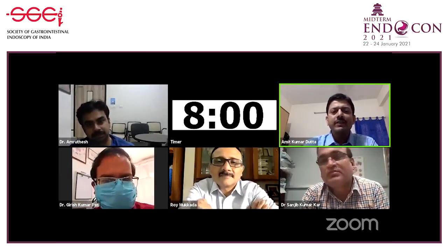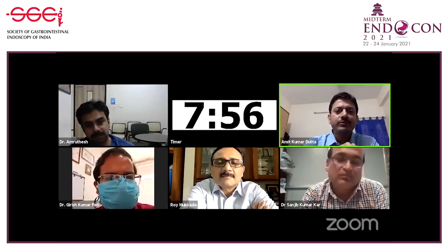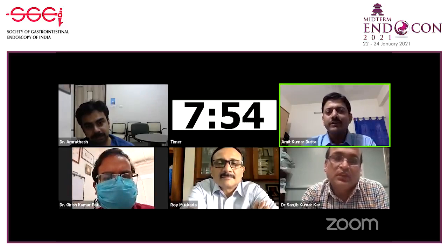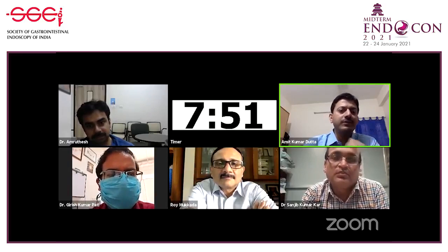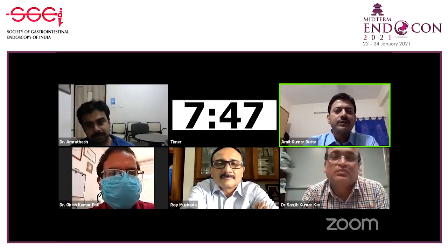So finally, even after ESD, which you do, if your base is clear, that is the most important part of staging. When you do a specimen dissection and send it to the pathologist, the result you see is also part of your staging. If the edges are free and clear, the therapy is done. That's what you take as the final part of your procedure.